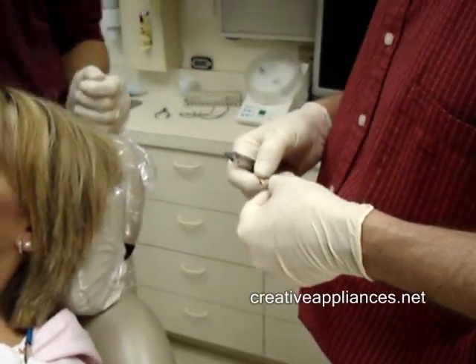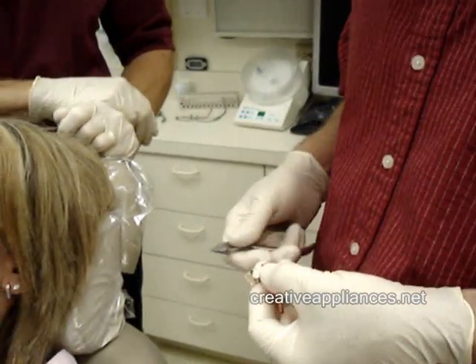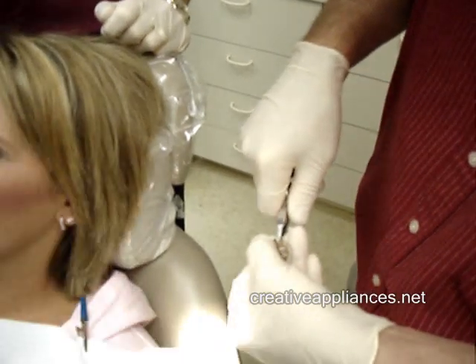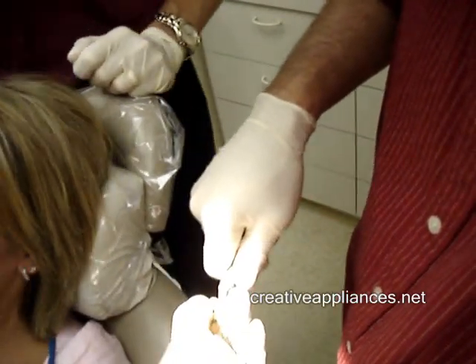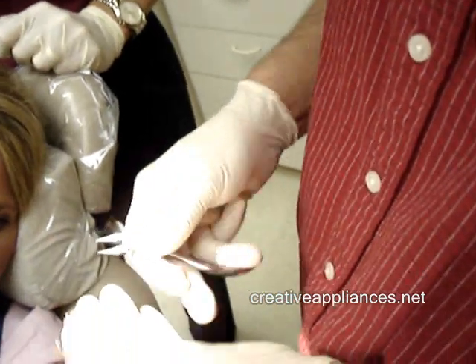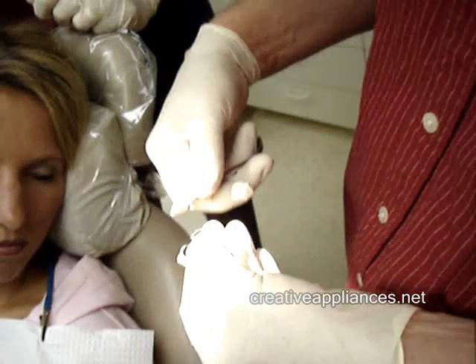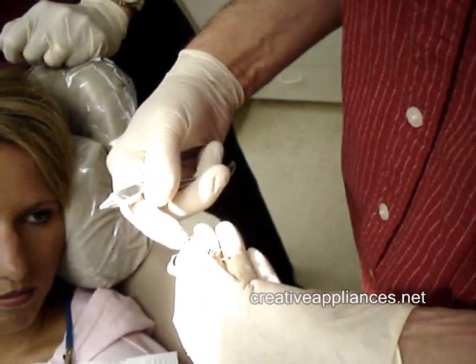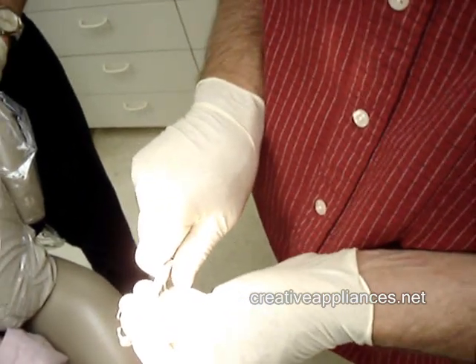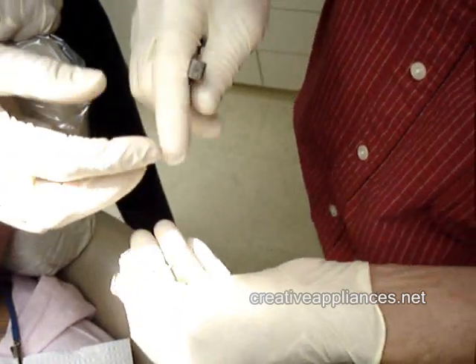There are actually four moves in making this adjustment. Use a bird beak plier and you want to open this up. So now you're just doing a rotating move? No, I'm just squeezing it — straight squeeze. Now, any time on a labial bow, any time you adjust one side, you do equally the same pressure on the other side. Just a little squeeze.